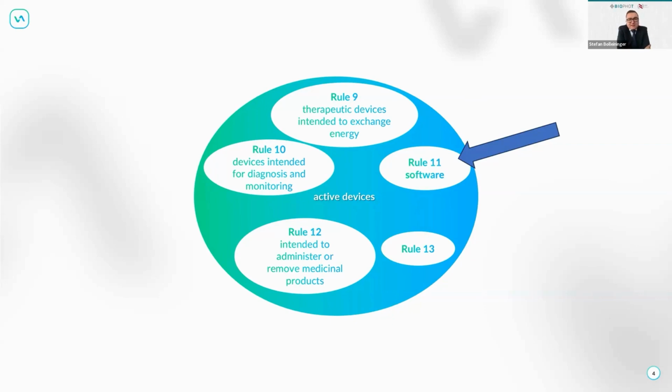If the device is very critical, however, the outcome, the timeliness or the direct usage will not kill a patient, however it can severely damage them, class 2B. If the device does diagnostic or therapeutic decisions and does not kill the patient or not severely damage it, then it will be a class 2A product. And all others will be class 1.